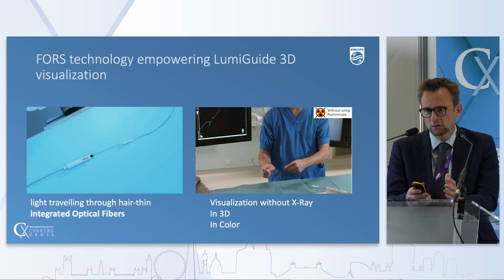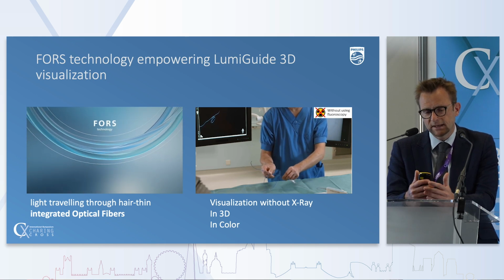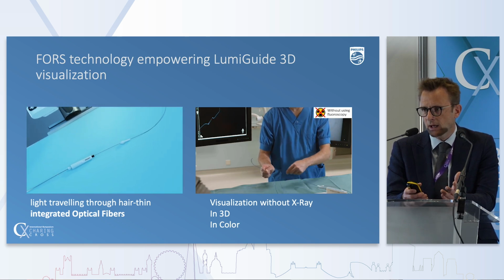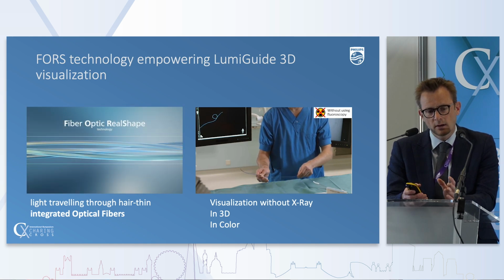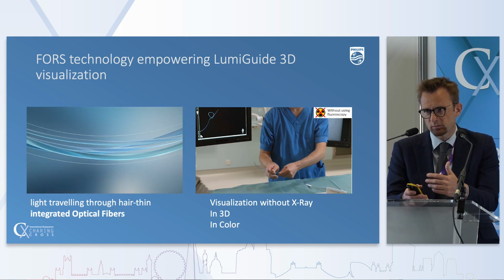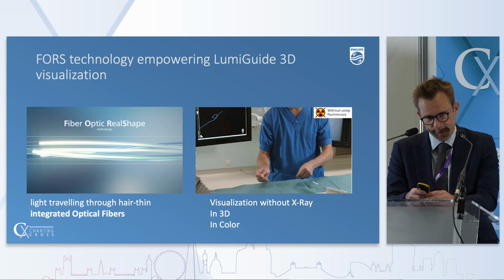I think the FORS technology is a step forward, in 3D, in navigation. As you can see, this physician is able to manipulate both the wire and the catheter without doing any X-ray, and this in 3D and in color. Basically how it works: devices can be tracked using light traveling through hair-thin integrated optical fibers. When you send laser light in the fiber, the way it is reflected gives you the ability to reconstruct these devices in 3D and in real time.